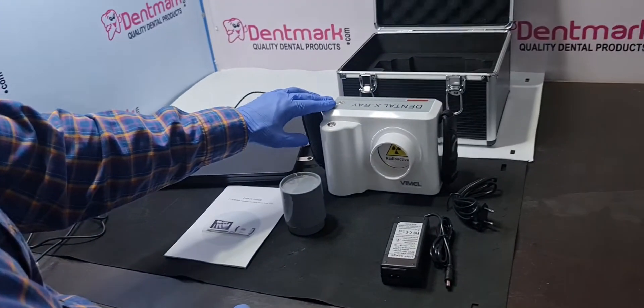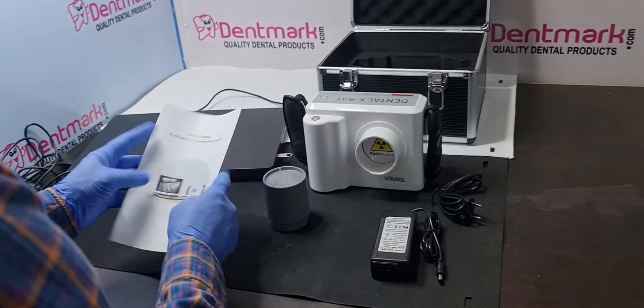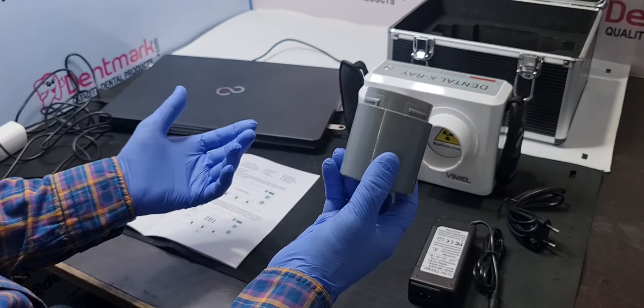So this is the portable x-ray, charger, power cable, this is a manual, and this is a beam limiter.